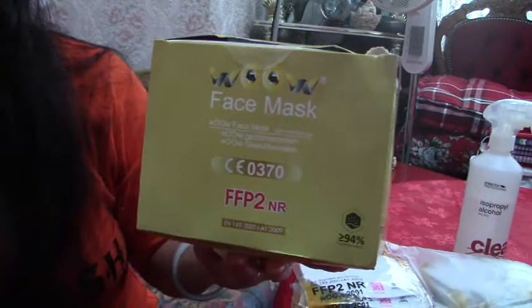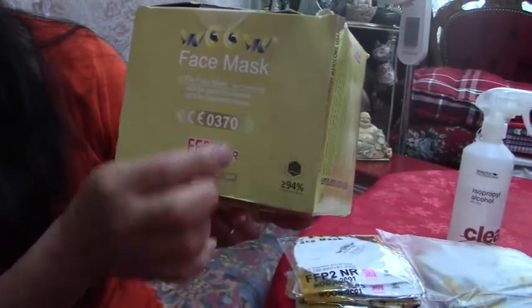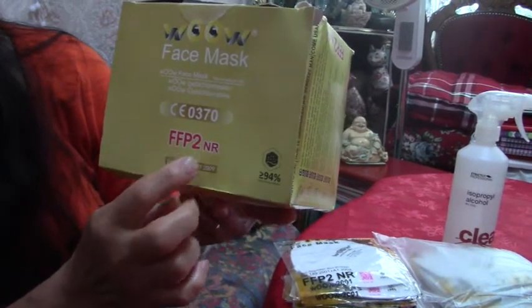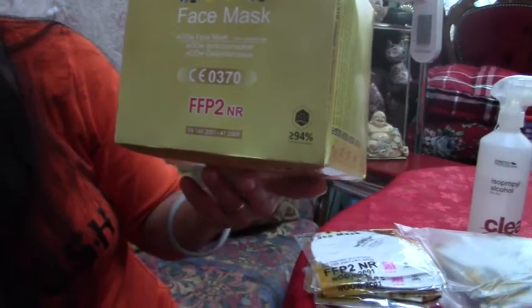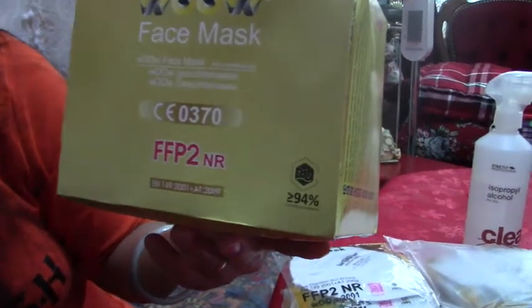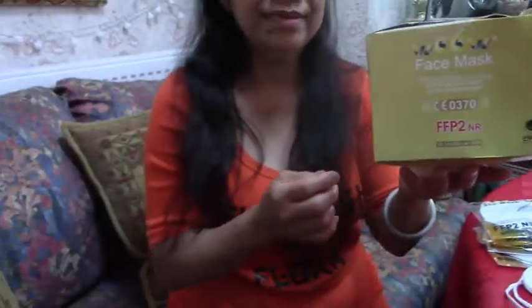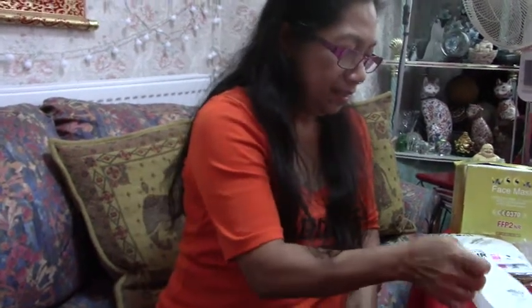So you can't really see it. It's the Woow FFP2 NR face mask. So that is the very good one. Supposed to be 94% efficient. So it's still 6% getting through. And if the sides stay open, then it lets in a lot more virus. So you have to make sure it's closed.